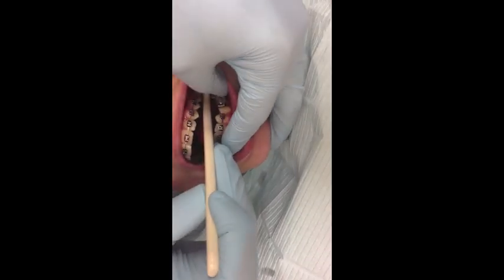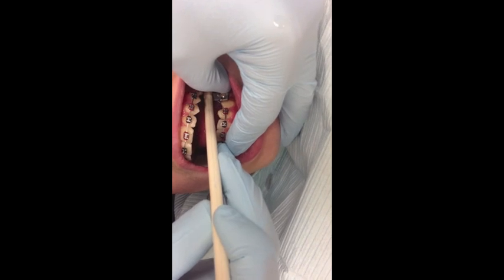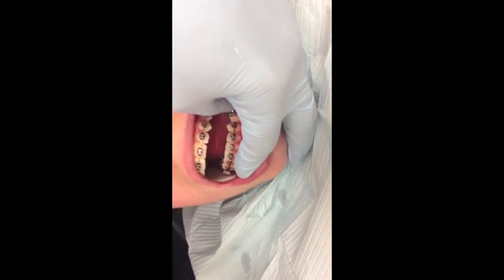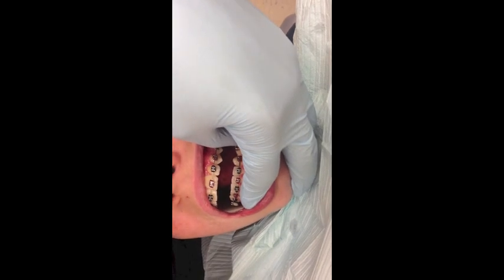Bite down, squeeze, squeeze, squeeze. Open — bite. Let's get a little green brush and take it out from under the bottom of the band.